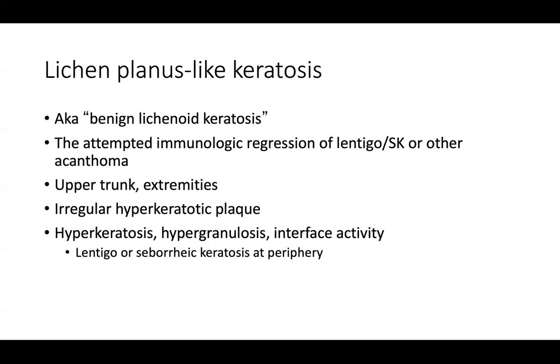I will mention to you there is a diagnostic pitfall in lichen planus-like keratosis that can be disguising melanoma in situ. And so I will talk about that briefly, because many times I will really critique these lesions and make sure that there's no melanocytic proliferation that's being regressed within these LPLKs or BLKs, as they're called.